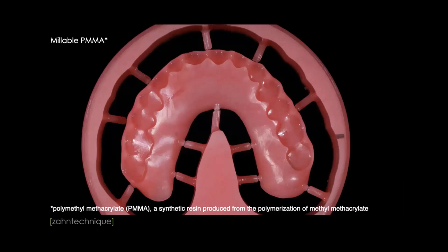The industrial manufacture, right? They're actually like regular acrylic, basically, but they're really cooked and pressed in big machines. It's high pressure pressed acrylic. So they're super, super strong with that, and very dense. That's why they're so nice to mill, or actually also very tricky to mill. Our milling machines or burrs don't like them, but they have an extremely smooth surface.